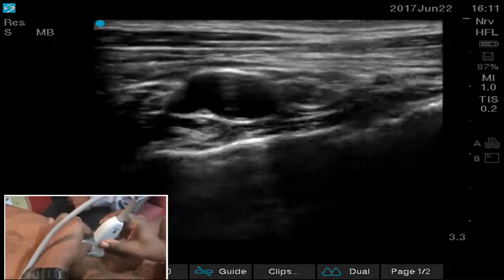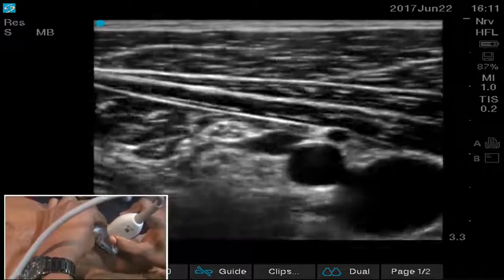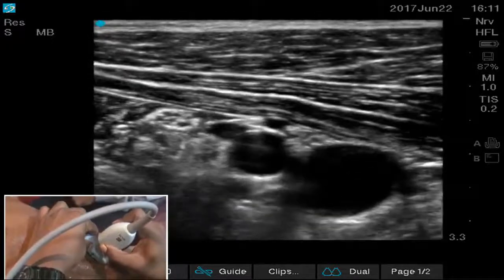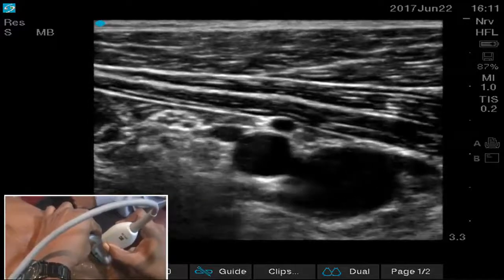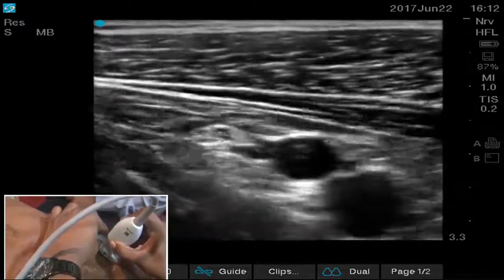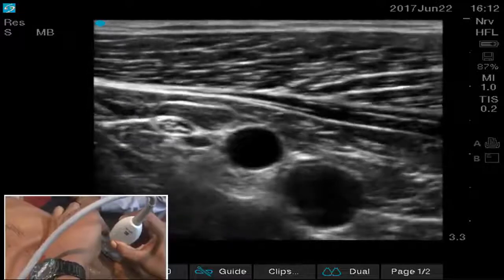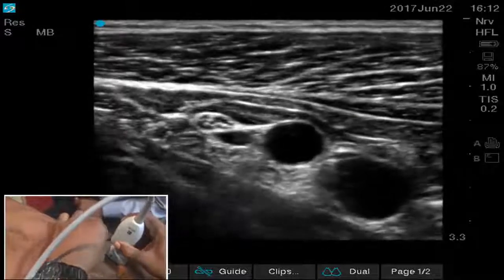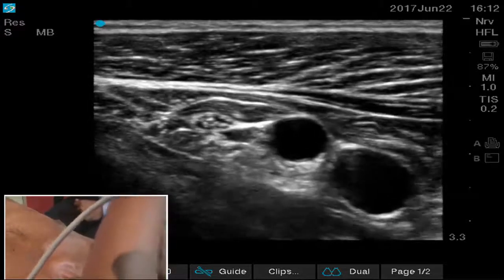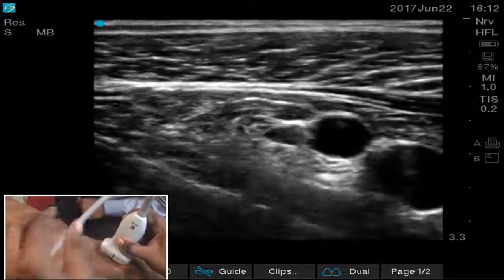Now from there, if I scan the brachial plexus elements laterally, you will see the nerves wind around. Now you can see the axillary artery pulsating and the neural elements distributed. One is on the medial side, and you can see the nerve roots migrating towards the posterior. The posterior cord goes behind, and as I go more and more lateral, you can clearly see the three cords: the lateral, the medial, and then the posterior. As I scan, the cords completely wind around the axillary artery. This is the lateral infraclavicular block.